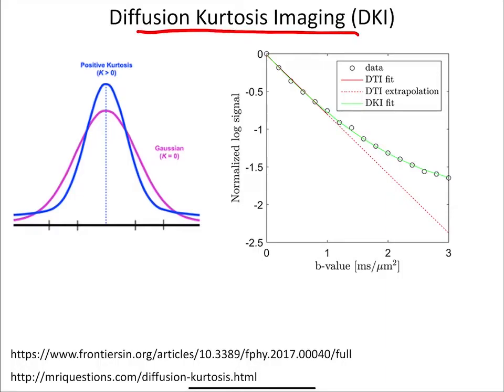The data actually looks like this: DTI and most models will fit just a straight line, and diffusion kurtosis imaging is trying to model the fact that the diffusion doesn't happen as quickly as you think it should. For example, if it was just pure free diffusion, the particle distribution would look like a Gaussian. In practice, what we see is things don't fall off that quickly. Particles are trapped, and so the diffusion isn't as fast as we think it should be.